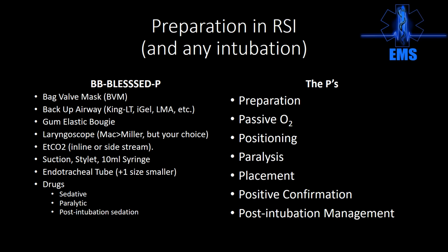If BB blessed P doesn't work for you, then you can make your own checklist, as long as you have some type of memory mnemonic that triggers the gear you need and the sequence of events you need to complete this procedure in, then it works.